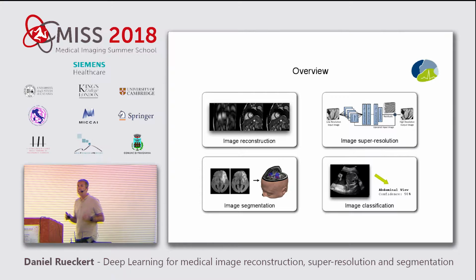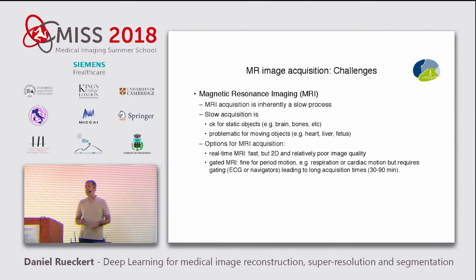The data set we're going to use is MR imaging, and similar challenges exist for PET image reconstruction, CT image reconstruction, for almost all forms of tomographic reconstruction, except that the imaging physics is slightly different for every application. Nevertheless, all of what you see here, you can apply to CT imaging or PET imaging. So here is the problem.